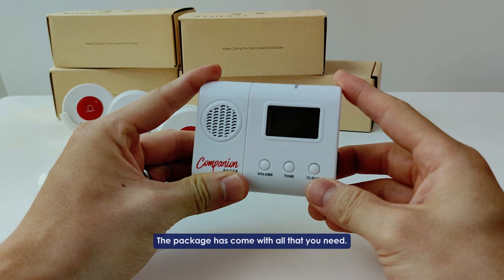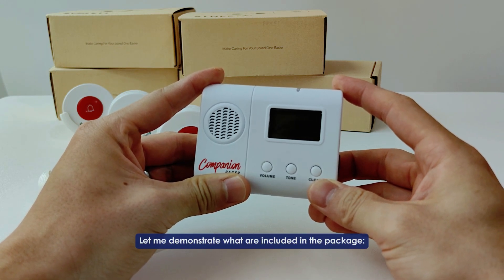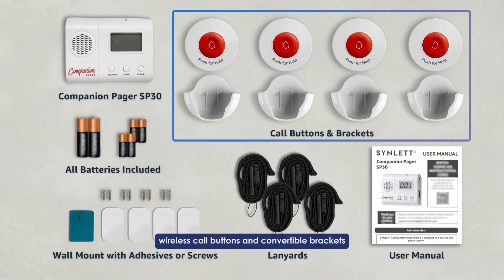The package has come with all that you need. Let me demonstrate what is included: the companion pager, which is here, wireless call buttons, and convertible brackets.